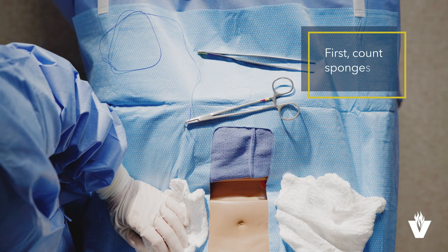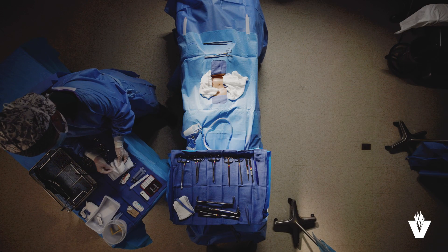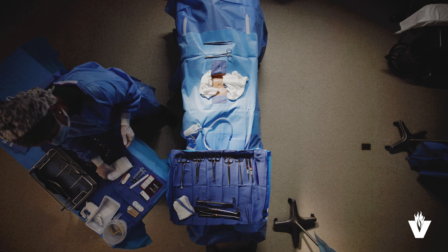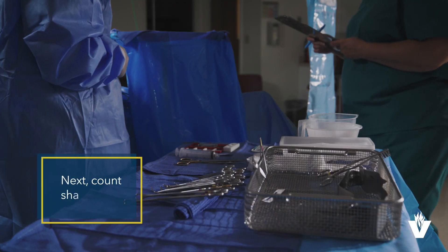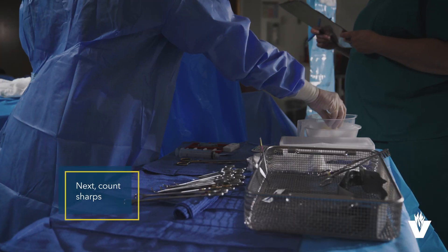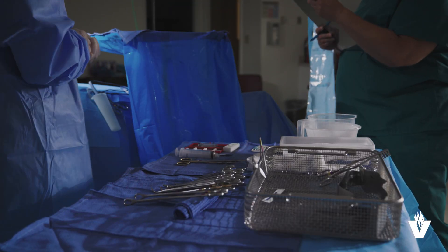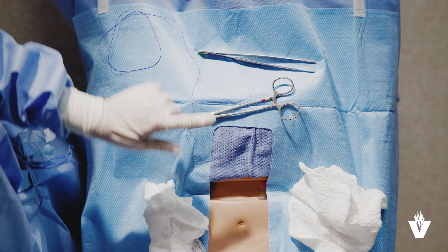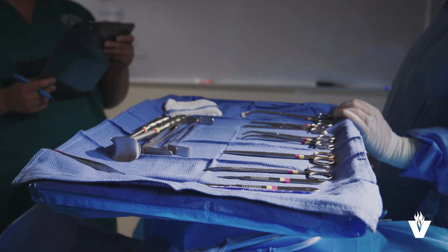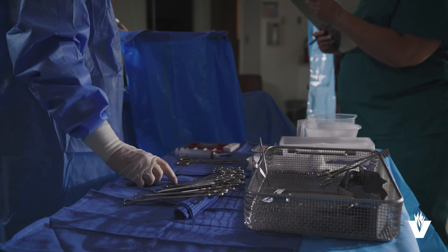Begin with the sponges such as Raytex or Laps. Raytex: one, two, three, four, five, six, seven. Then the sharps like sutures or blades and accessories. One, booby tip, one. Start with the items on the sterile field, then those on the mayo stand, then the back table, and finally those off the field.